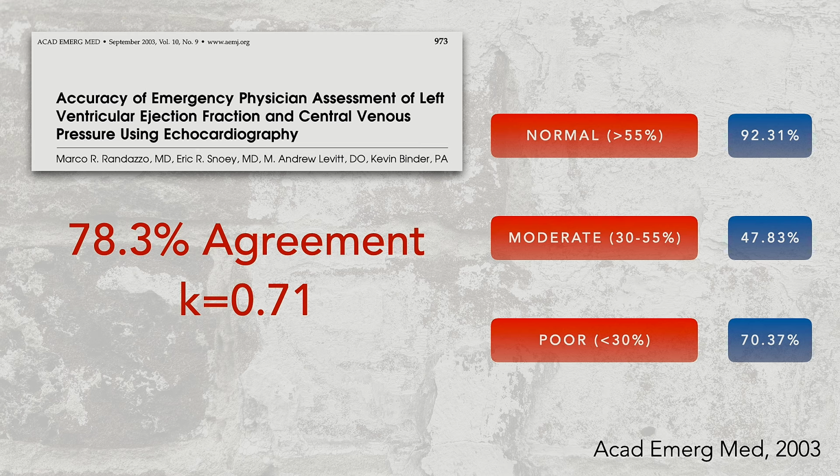Then they had the patient get a comprehensive echo, and they excluded patients who had an echo today and a comprehensive one three weeks from now, which doesn't make any sense. It had to be within 4 hours, I think, of each other, some limited time range, and they asked, how good are they at doing this?